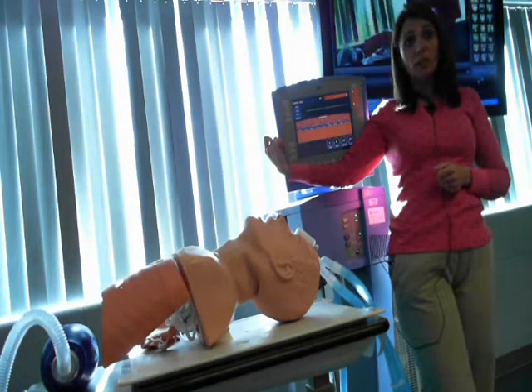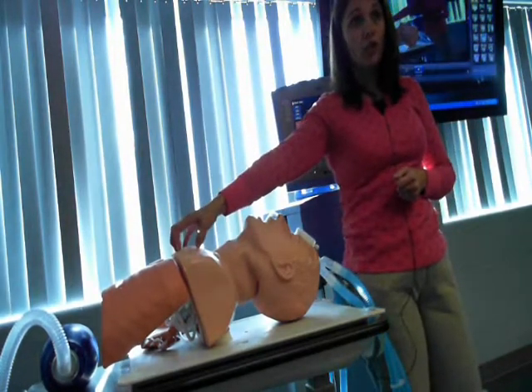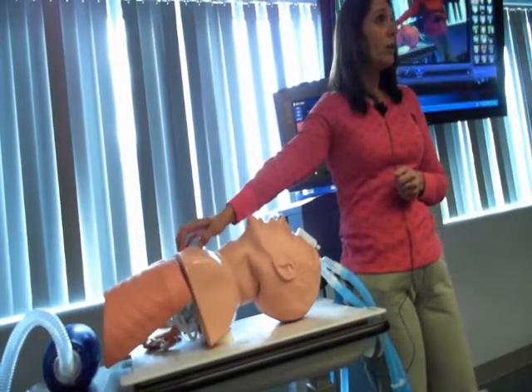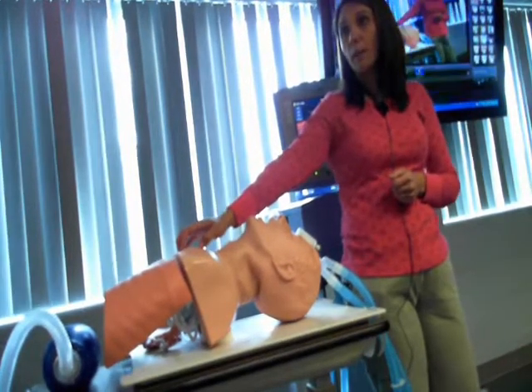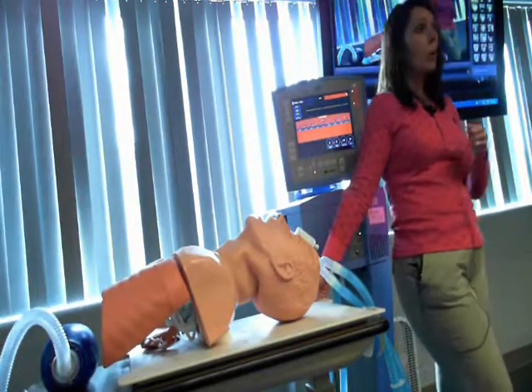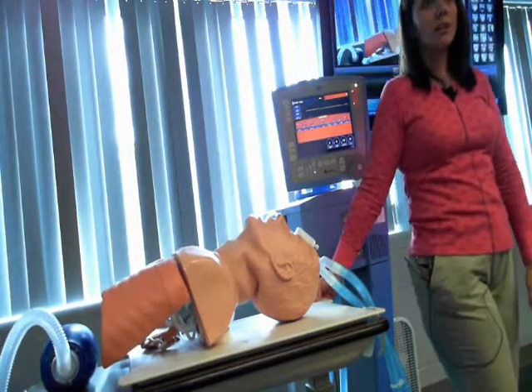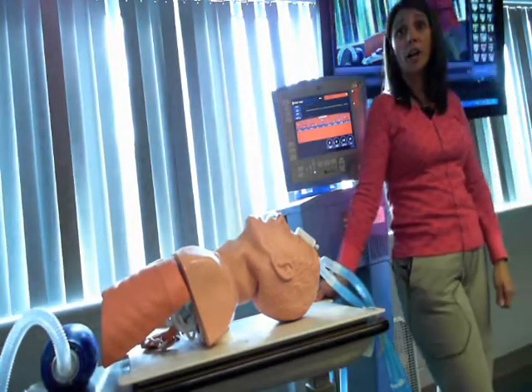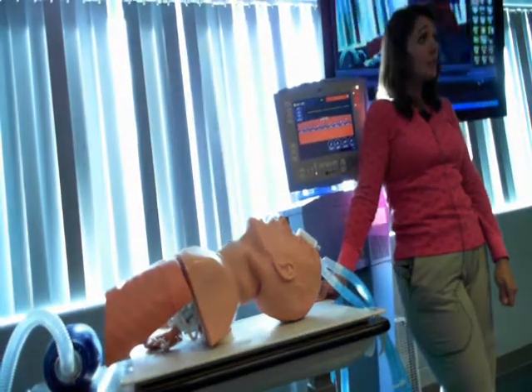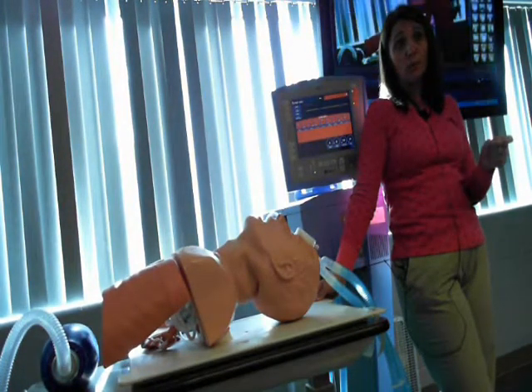So if you can't figure out what's going on, you focus on your patient. You look at their color. You always go back to your basics. Assess that patient. Look at them. Are they anxious? What is their work of breathing? What is their heart rate? What is their color? You know what? This thing back behind me is a $50,000 squawking hunk of metal at that moment. It's useless. That patient is most important, and the next most important is you.